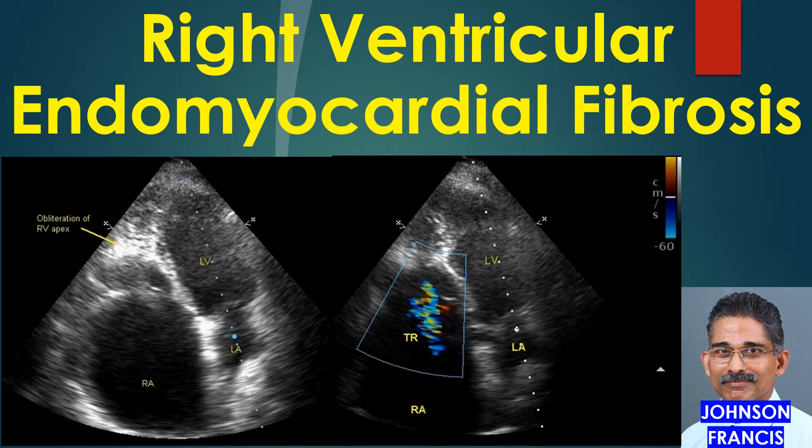Color Doppler echocardiogram in right ventricular endomyocardial fibrosis. Endomyocardial fibrosis is a type of restrictive cardiomyopathy seen mostly in the tropics and subtropics. There is progressive fibrosis and obliteration of the right ventricle, predominantly in the inflow tract and the apex. The right ventricular outflow tract is relatively spared and is often dilated.